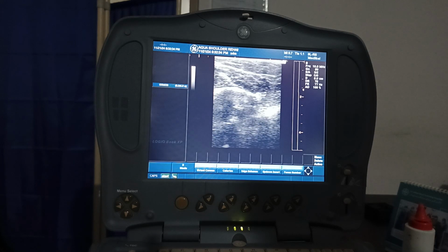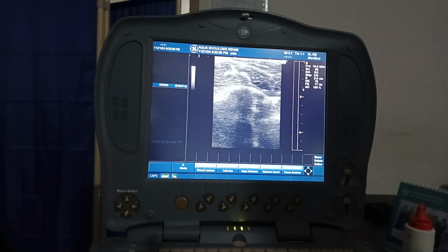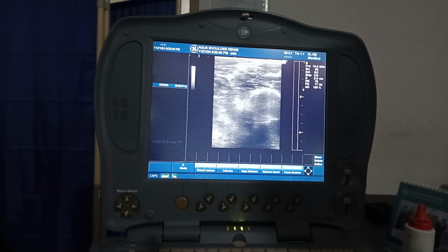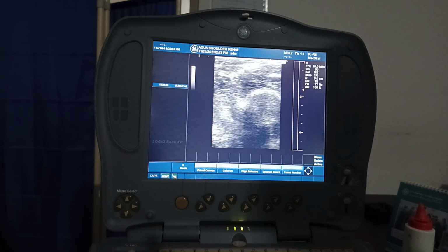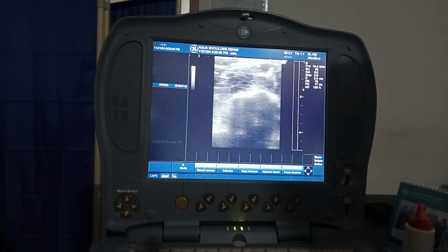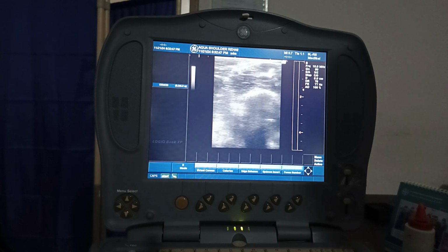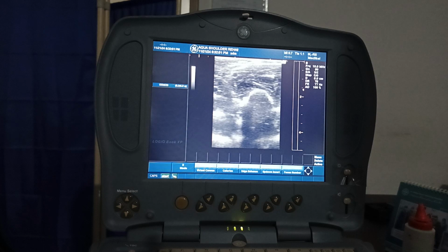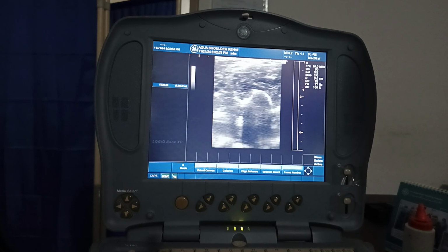She has very thin blood vessels maybe, or I am unable to. Yeah, I got one. Don't worry. I got one. That's it. Please, can you? I'm sorry. You have to hold it over here. This your hand. Thank you.